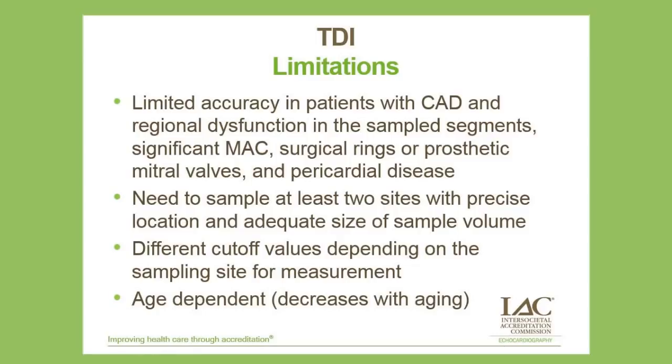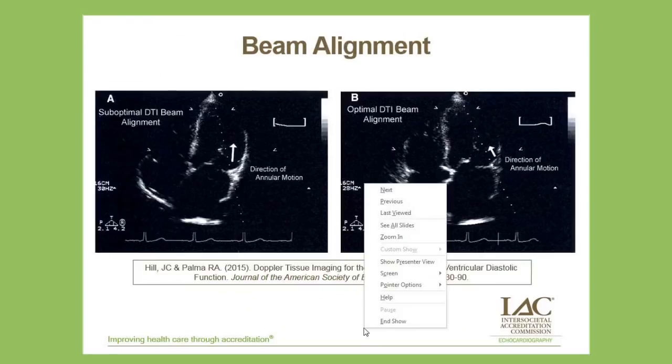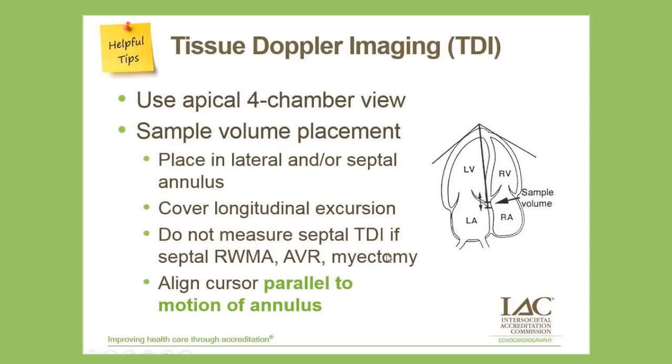And there are different cutoff values depending on the sampling site for measurement, whether you're septal or lateral annulus. And again, this is age dependent. It will decrease with aging.